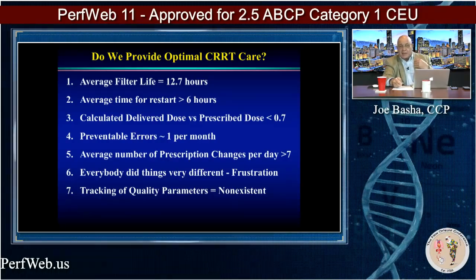And look, I'll tell you that anecdotally, I realize I've never done my own randomized control double-blind study to explore CRRT, but I've got a pretty good amount of anecdotal experience with this device and with this therapy, and it has saved, I mean, no question, I have saved patients' lives by being able to offer this as an option for them in hospitals that didn't have it. We can talk more about those grand stories. We all love them in our business. It's what makes us want to do what we do when we actually help people. But I've got a lot of stories, and they're good ones, and I've seen it make a huge difference. And it has a lot of utility.